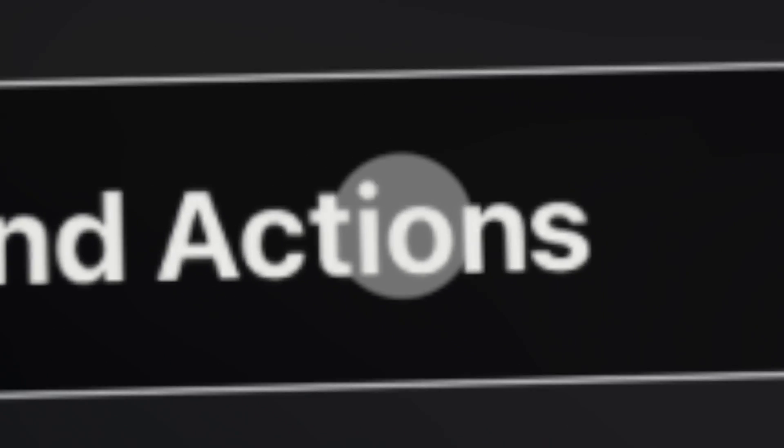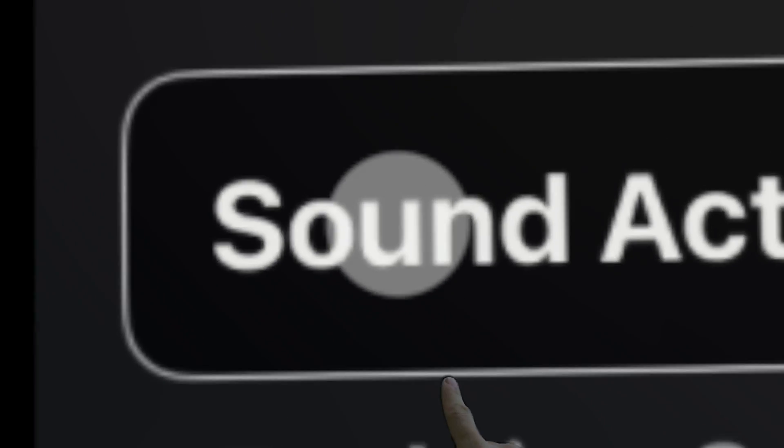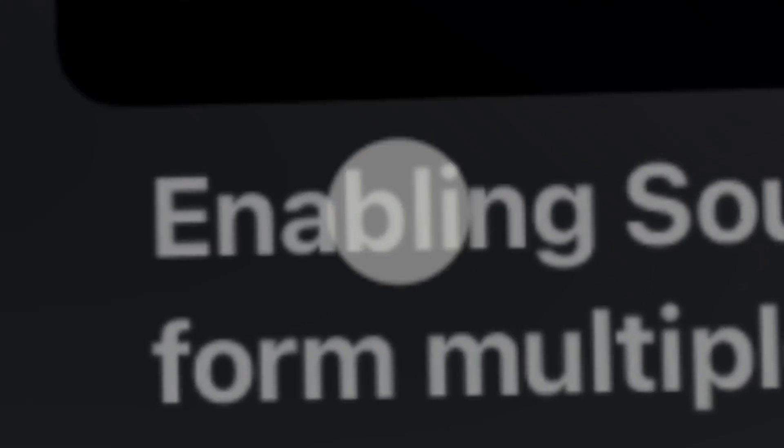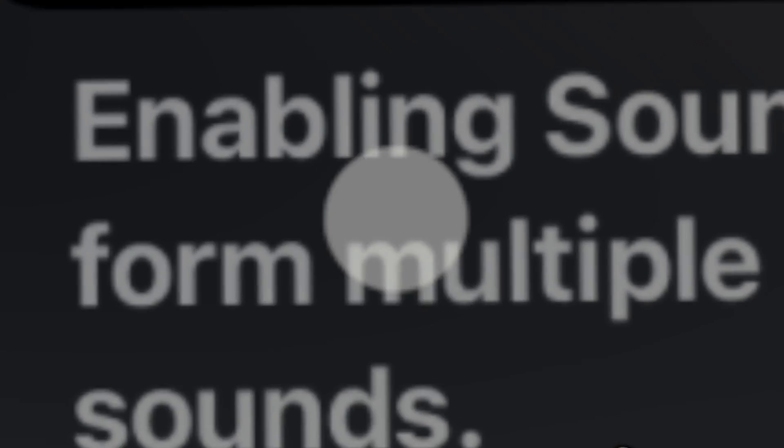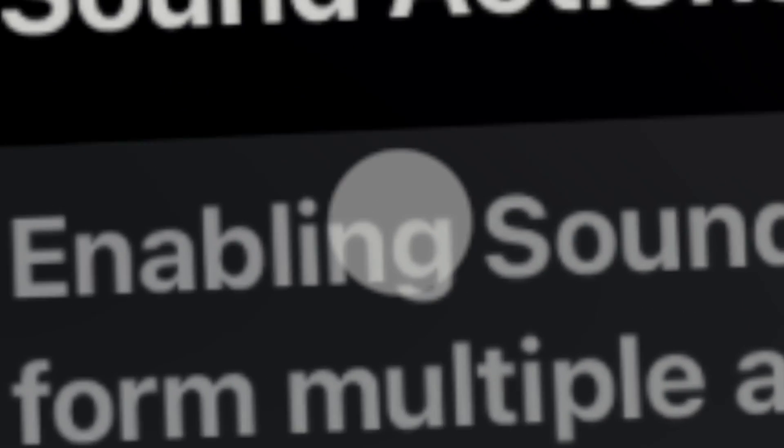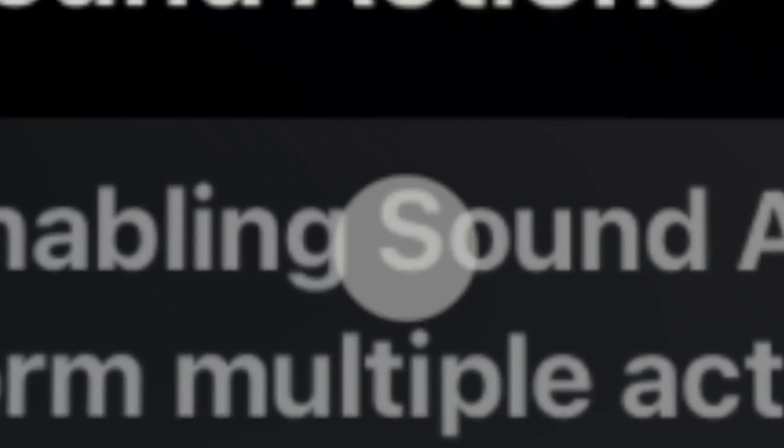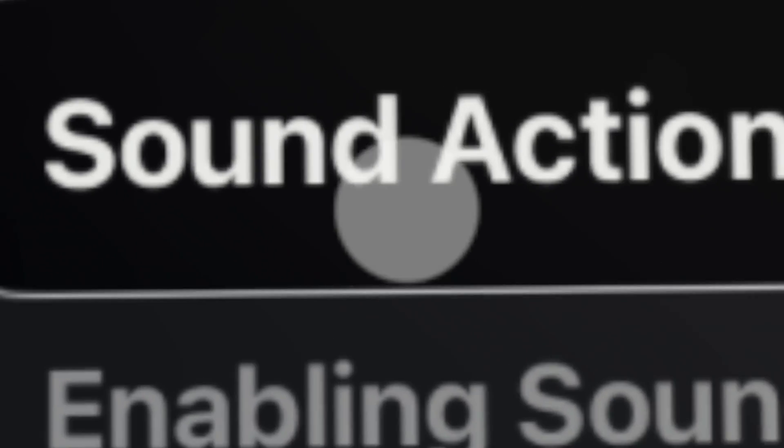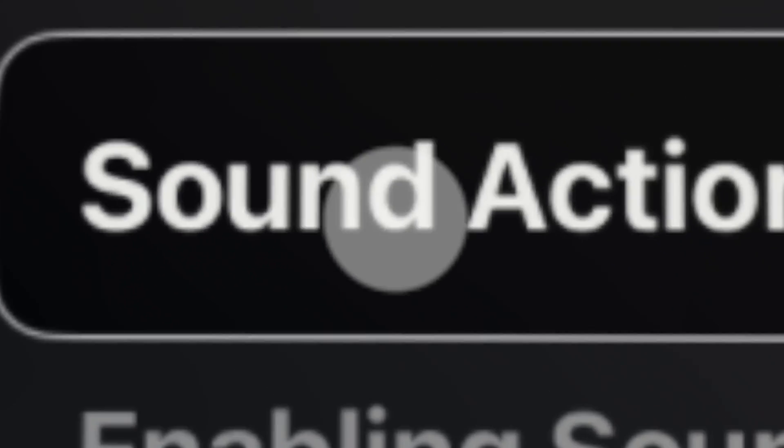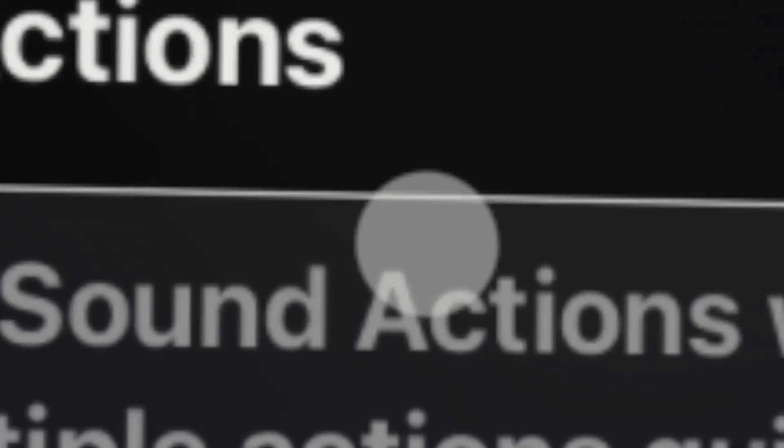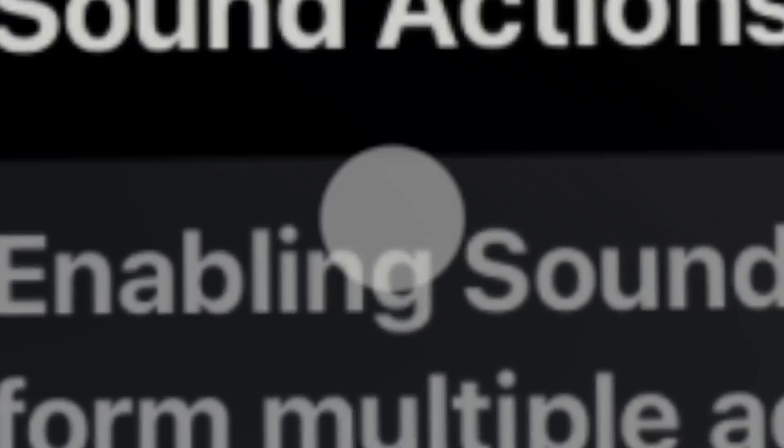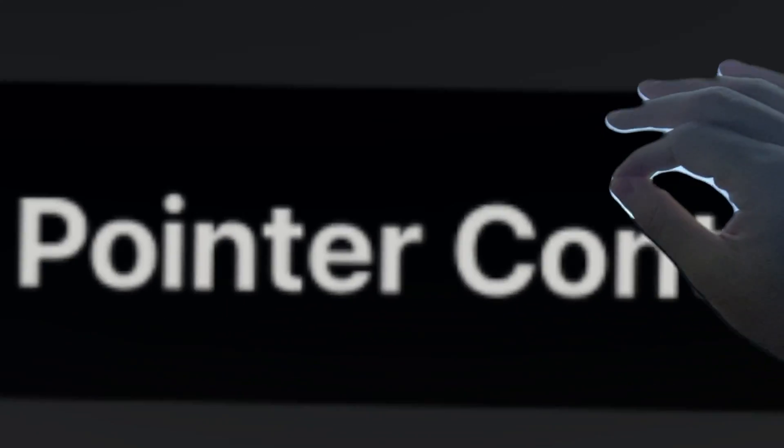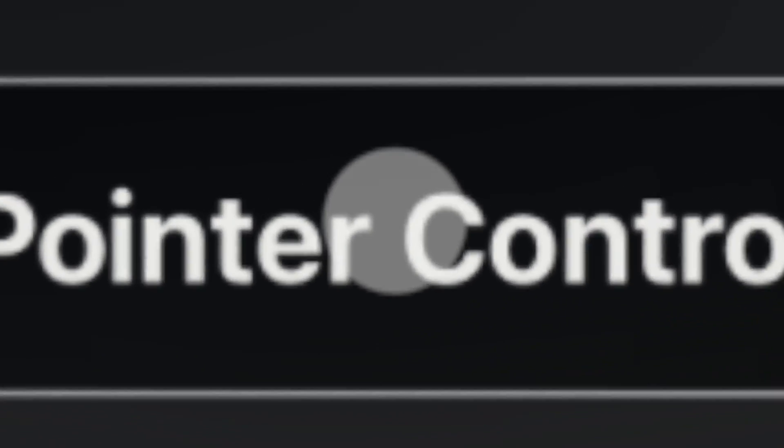To enable the pointer, we go into physical and motor, and we want to click on interaction. In here is the sound actions. I talked about this in the previous video, how really cool you can customize certain actions with sounds. There's a great video on YouTube of a gentleman who doesn't have arms, and he has set this up to where he's using the pointer like I am. And when he wants to tap on something, he does like a click with his tongue. And he's got a bunch of other sounds set up. It's really, really pretty cool. And here is pointer control. Click on that.